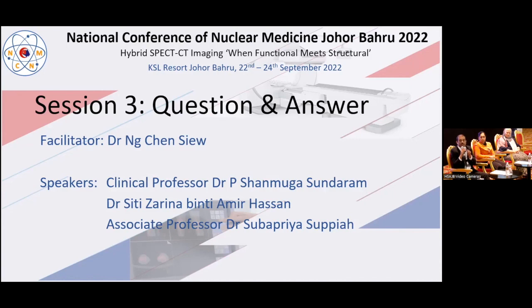Yes, it is very important to understand the presence of multinodular goiter or thyroid pathologies adding to our confusion. So because I use a dual phase plus SPECT-CT, I personally feel subtraction scan should be reserved only for those rapidly washing out adenomas, which is less than 10% in our day-to-day practice. And those 10% of patients have to take the trouble of coming the next day for a subtraction scan.